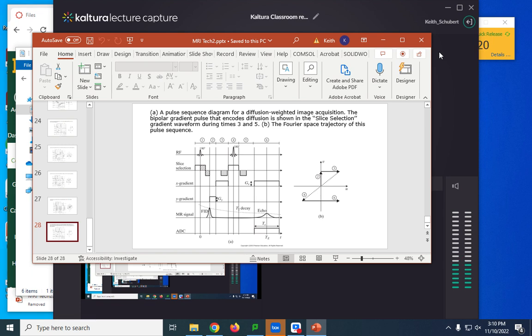I have another question. Sure. Since it's taking a long time, do we have to do breathing stuff to make sure it's all lined up correctly? This is where you do have to be a little bit careful. You usually try to get everybody relaxed and sleeping because that slows down heart and breathing rate if they can be calm. If not, you would have to do some amount of adjustment. We typically do not.